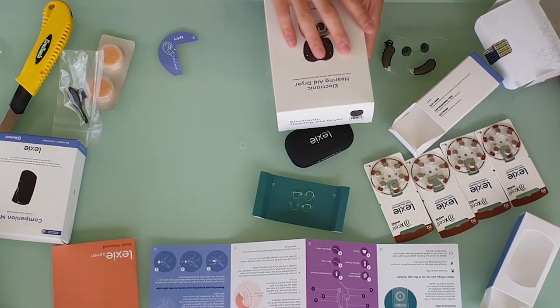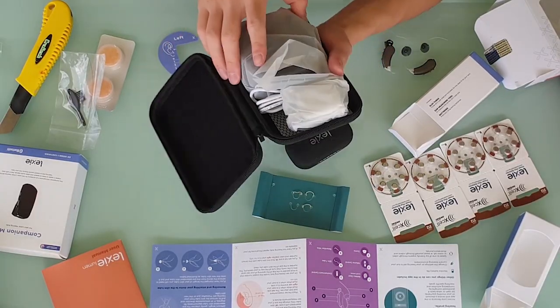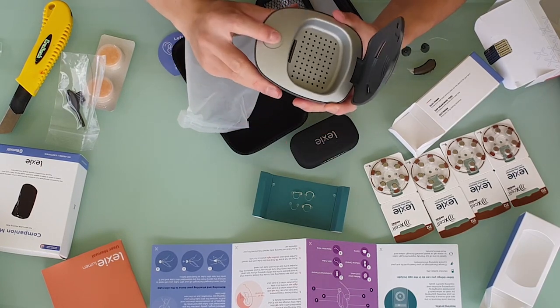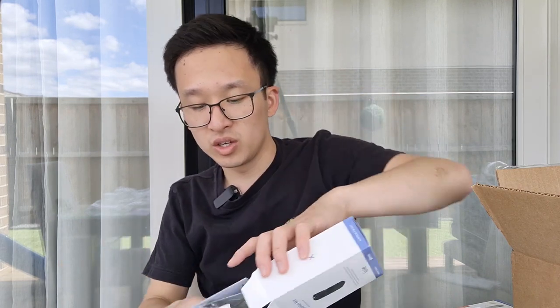Before we do that, let's do a quick unboxing of the electronic dryer and the companion mic to see what else is inside those boxes. The dryer comes in a very nice carrying case with everything inside. It has a really simple big on and off button and just your generic wall plug. That may be a really good option if you're somewhere especially humid, or if you're somebody with a lot of wax in your ears.